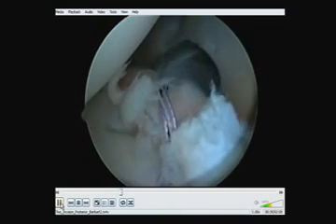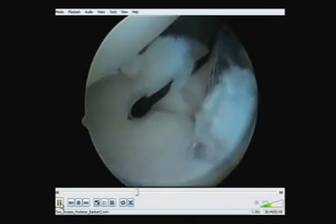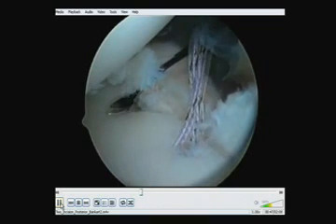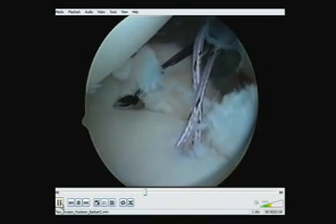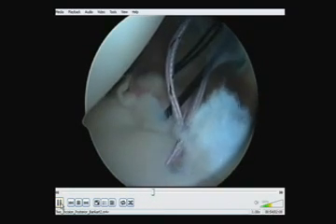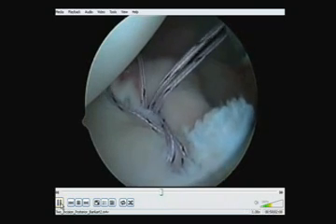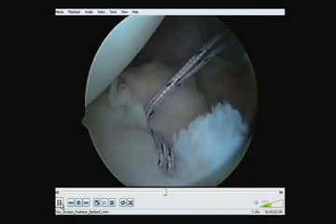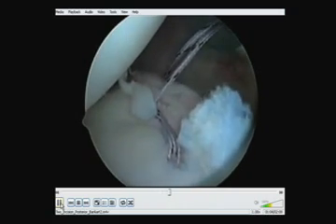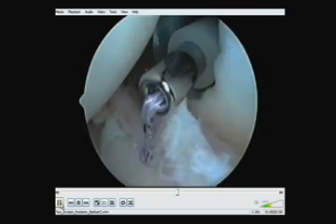See the anchors coming in here at 45 degree or dead man's angle, as Burkhardt described. Important here is that you go inferior to the suture because you're going to create a capsular shift by bringing one of those limbs of suture through inferior, and when you tie your knot, it'll shift nicely superiorly. This is done through one cannula, but you can have accessory cannulas if you have other work to do. This just happened to work well. So you can see it's going inferior in the capsule. We're about 1 centimeter off, so the nerve is not at risk here. As you tie down, you see the tissue buttress come back and shift up nicely.